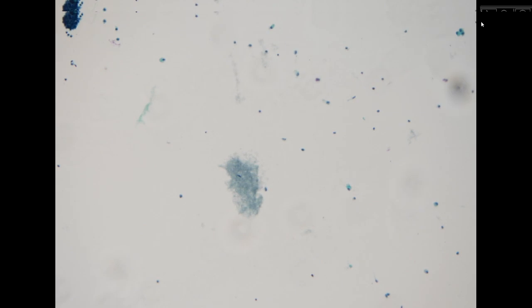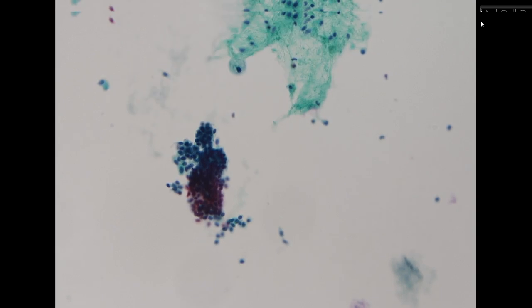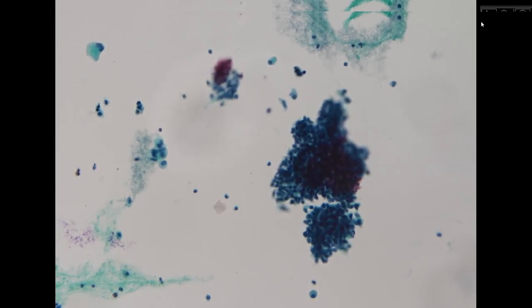So our diagnostic consideration was, could it be a salivary gland neoplasm with basaloid features? For this type of diagnosis, we will usually use a SUMP category 4B, and the differential diagnosis includes basal cell adenoma, basal cell adenocarcinoma, or adenoid cystic carcinoma.